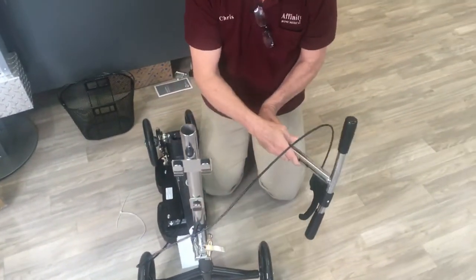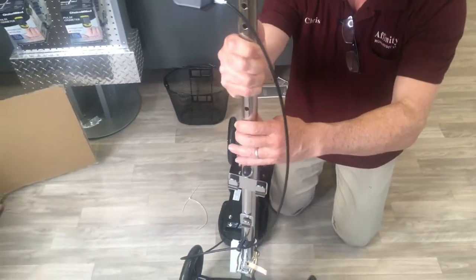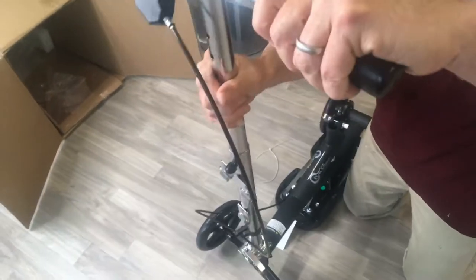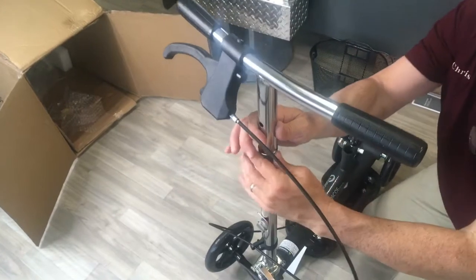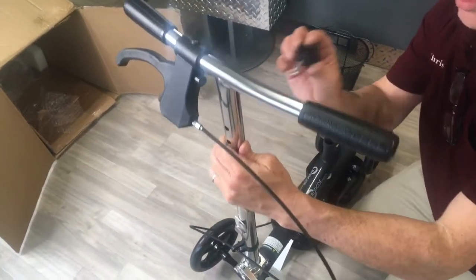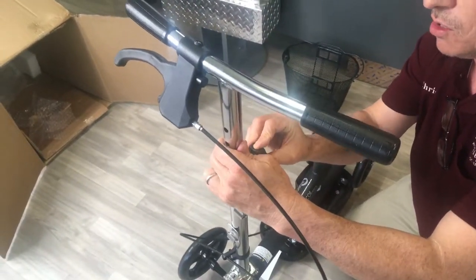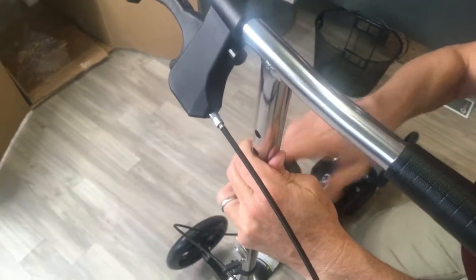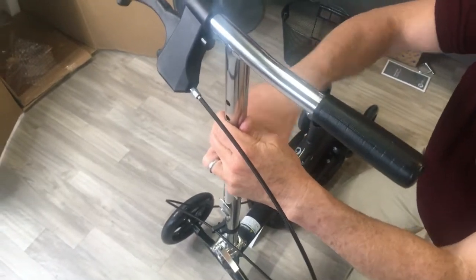Next, you can just place your actual handlebars into the top like so. The brake mechanism on this is going to be on the right side. You want to adjust this to your height, whatever height works for you, and in the box you will have this little piece that screws in from the back. Once you find that perfect spot, tighten it down and get it nice and secure.